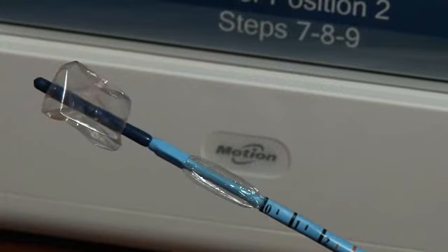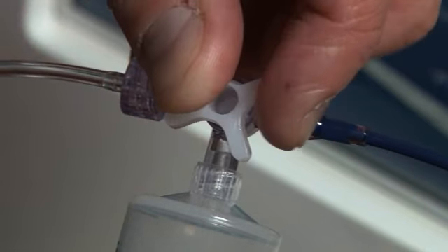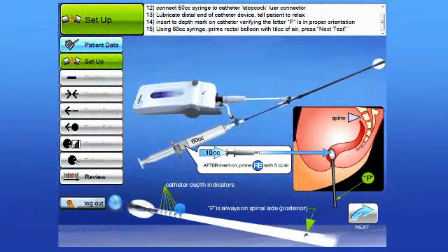At that time, once you're holding it with the 10 cc's of air, turn the stopcock so that it's now just communicating between the fob and the rectal balloon. 10 cc's of air are needed because this is an air-charged manometry catheter, and the air is used to transfer the pressure levels back to the pressure sensors in the portable manometer. Without having any air in the system, you would not be able to take a rectal pressure.